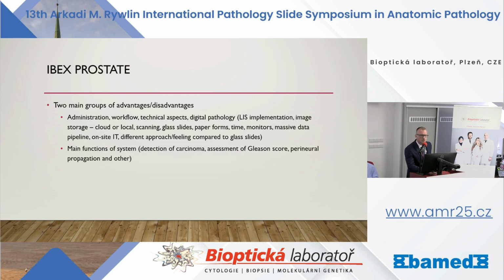If you don't have a good internet connection, everything will be terrible. And of course, you need really good IT management. And again, I'm an old school pathologist, so I really love my microscope. So when I look at the monitor, it's a really different feeling. It's not so pleasant for me, let's say, but you get used to it.